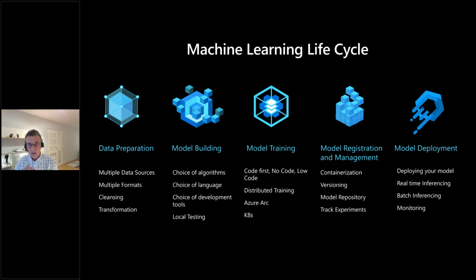When we look at the general life cycle of machine learning, and that applies not only to medical use cases but in general, most of the time we spend in these early phases of data preparation. So in medical settings, getting data out of PACS systems, doing data cleansing, doing the labeling, for example. The model building and model training parts are minor topics if you think of how much time we spend in the overall life cycle.